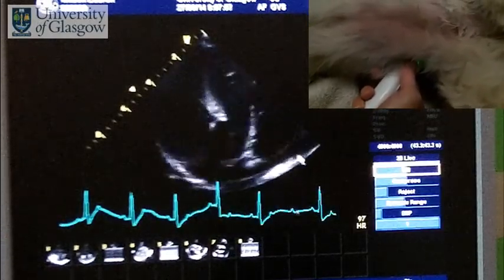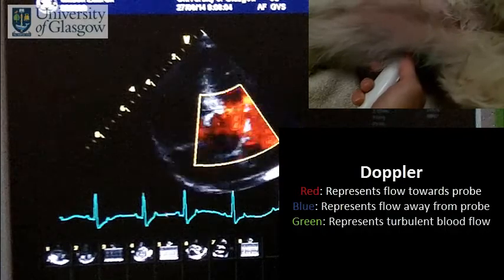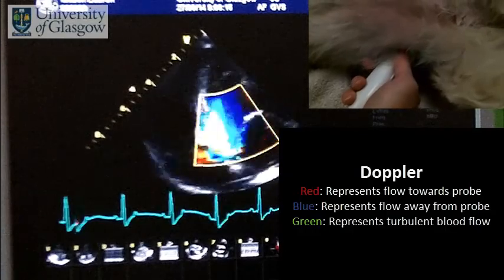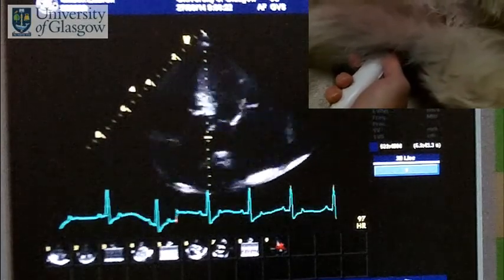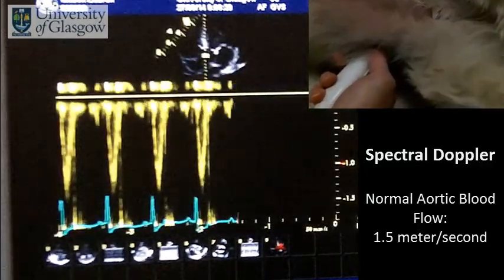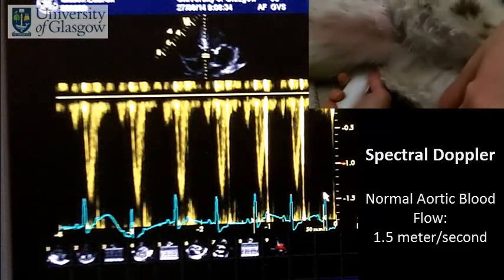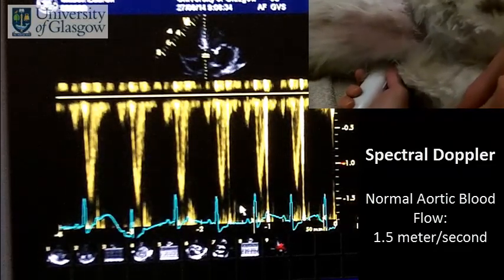We can look at the morphology and again put the color on to see if there's any sign of abnormal flow — there's a little bit of turbulence there. We can check that the speed of flow is normal by putting the cursor down across the aorta and using the pulse wave spectral Doppler to give us the speed of flow. The scale on the right-hand side goes up to 1.5 meters per second, and we can see the speed of flow is just reaching 1.5 meters per second, which is absolutely normal flow.